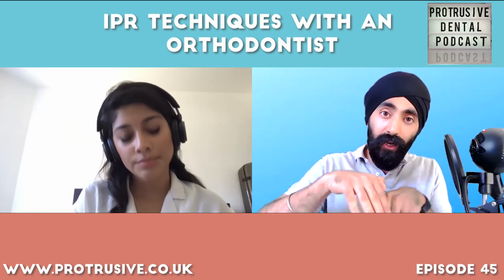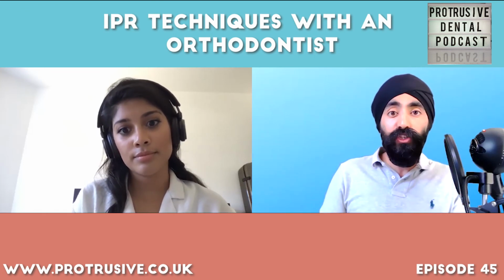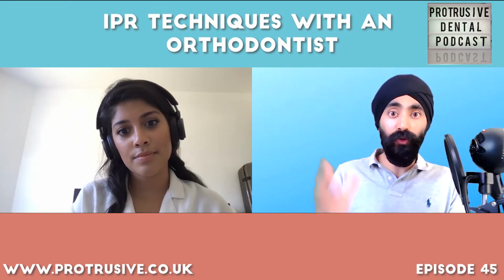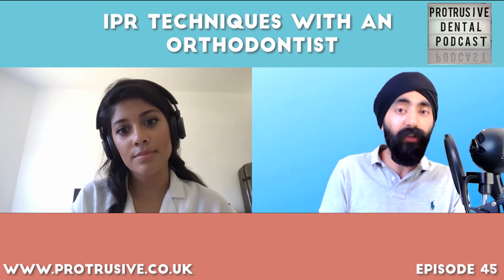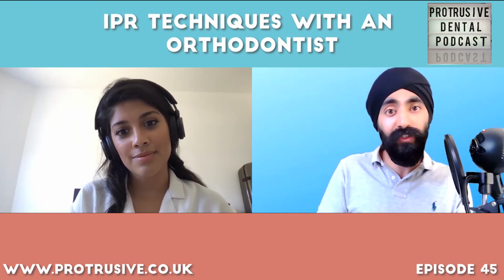And some teeth are aligning so that you can see the areas where you couldn't see before. So a lot of the times patients are thinking, oh my God, my recession's gone worse or whatever, but really it's probably not happened. But if it has, you need to make sure you're on top of it, and that's where your documentation comes in.